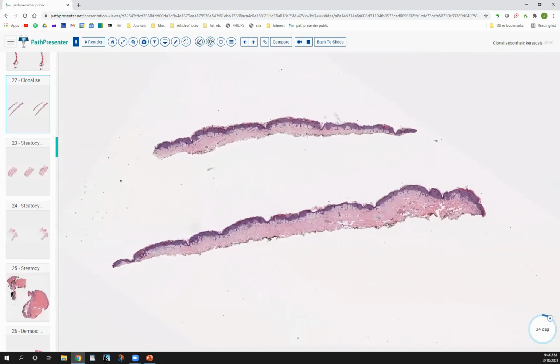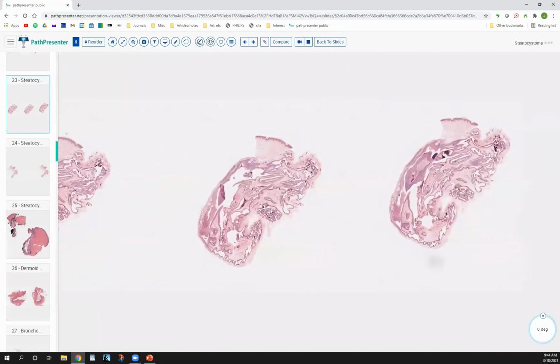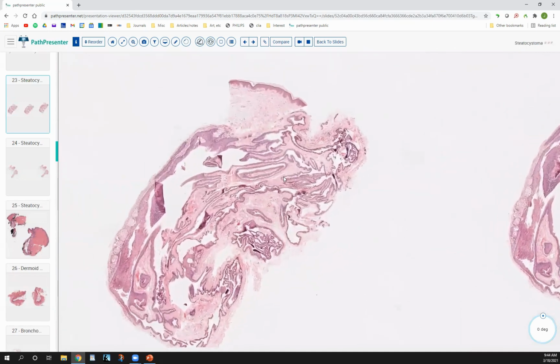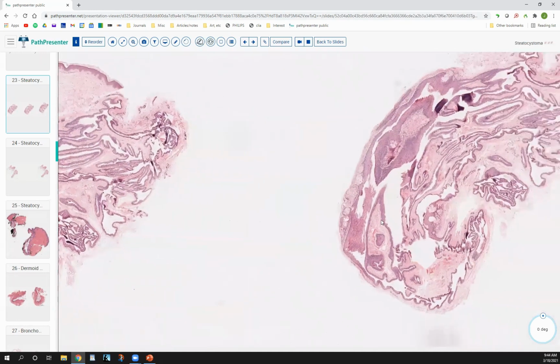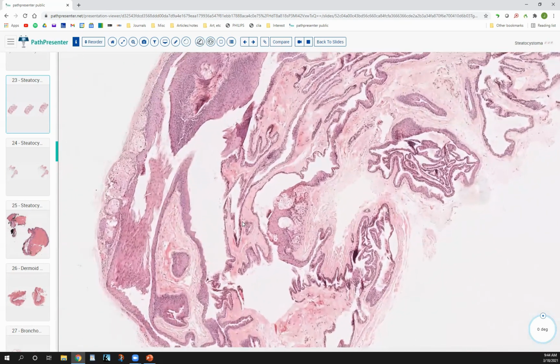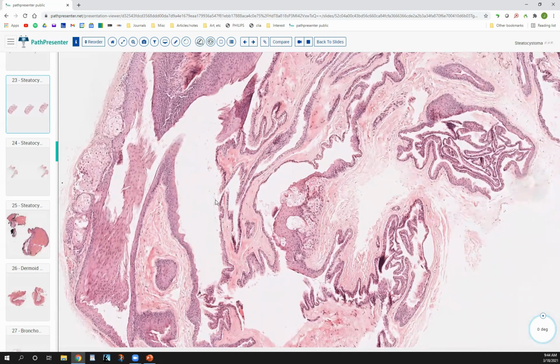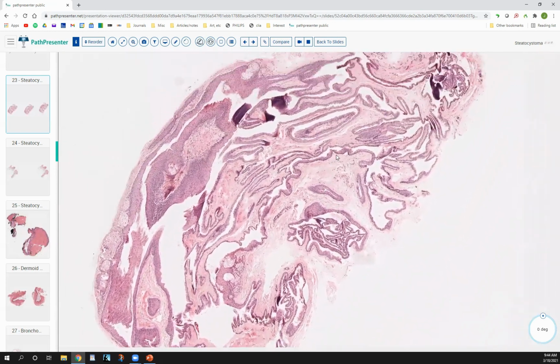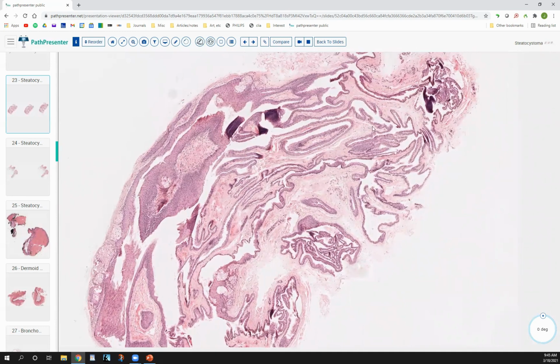All right, so as I said, we'd be switching back to cysts. So we're going back to the more unusual cysts, which I think are a little bit more interesting. So here we have a very convoluted cyst, and sticking with the same approach I was talking about earlier, there's really not much of cyst contents here. Maybe a few little frothy cyst contents, but you don't have the laminated keratin. You don't have the homogeneous keratin. So right away, you know you're dealing with some sort of a different type of cyst, and also the fact that it's so convoluted and complex appearing.